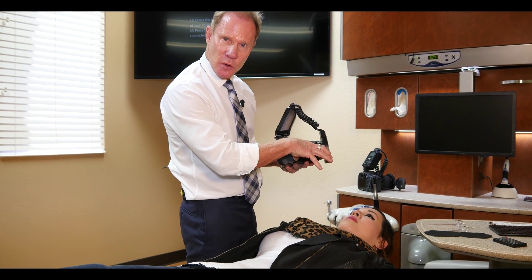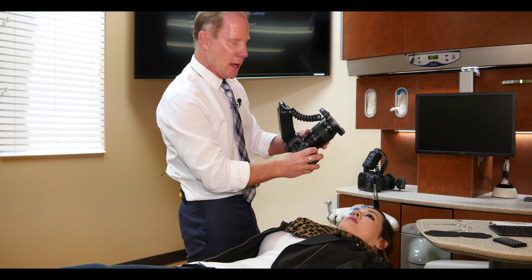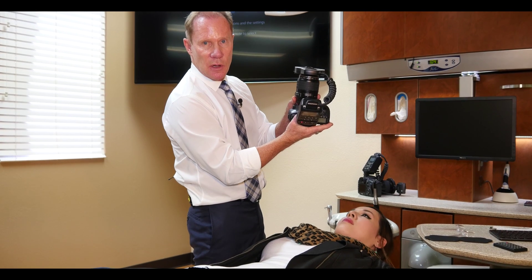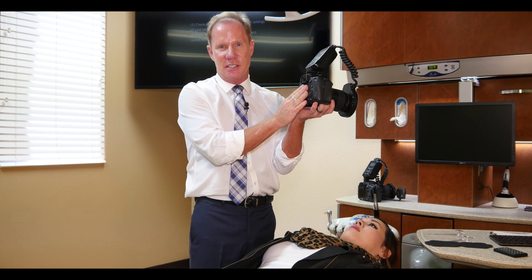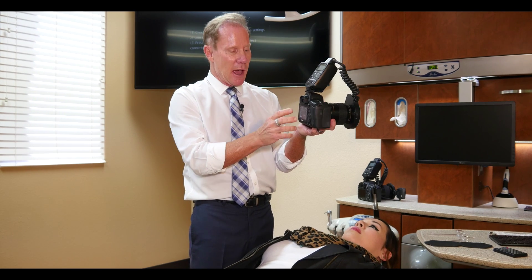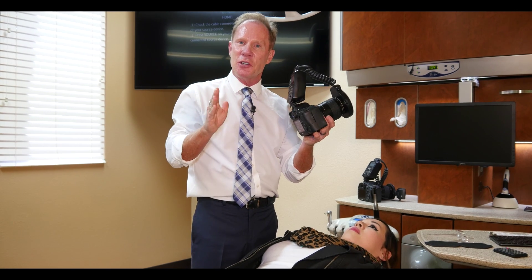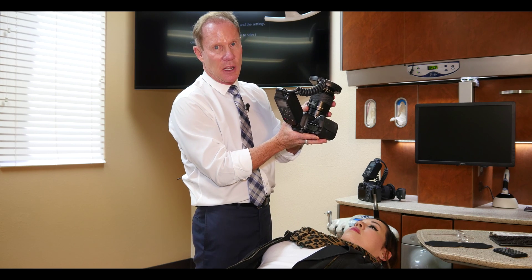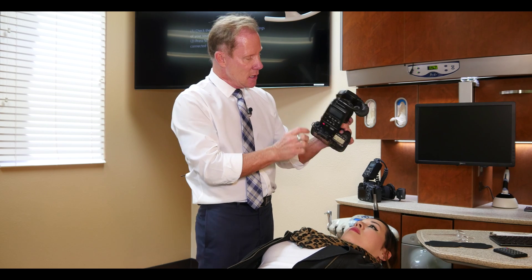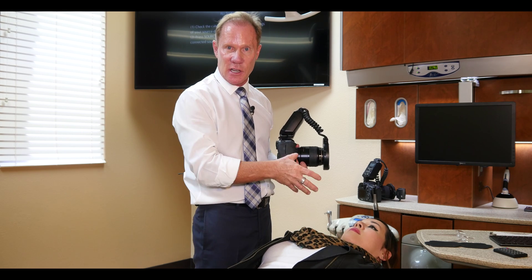We're going to take a full smile — a frontal view and a right and left. On our lens, we're going to shoot the frontal smile at a one-to-two ratio, so we're going to put the lens at two. This is assuming we have a full-size digital sensor. Not all cameras do — most digital cameras have a two-thirds size sensor, which means when you're shooting one-to-two, you need to set the lens at three. This is a Canon 6D with a full-size sensor, so we set it at two, giving us a magnification of one-half the image size.